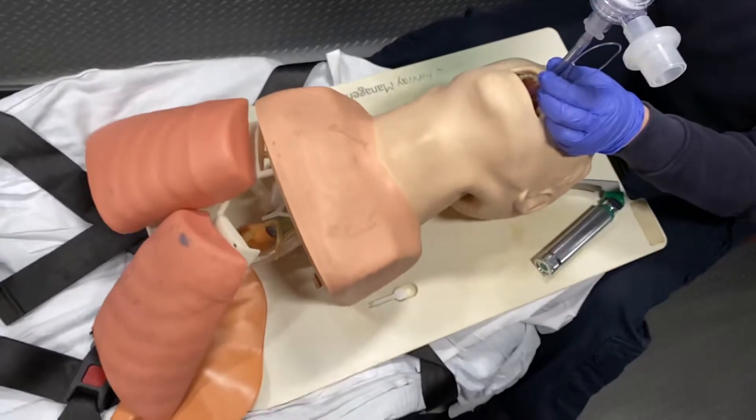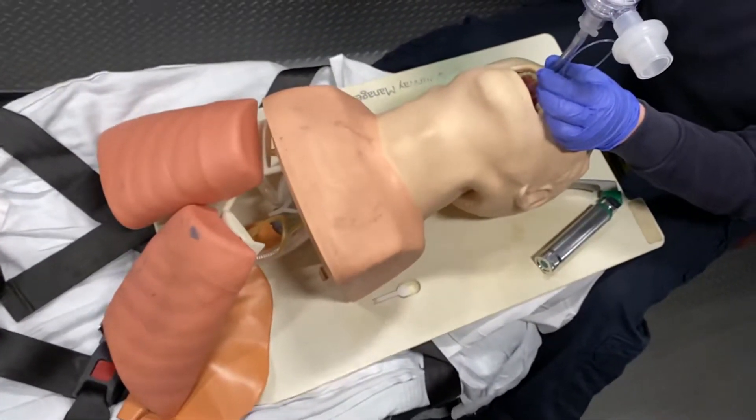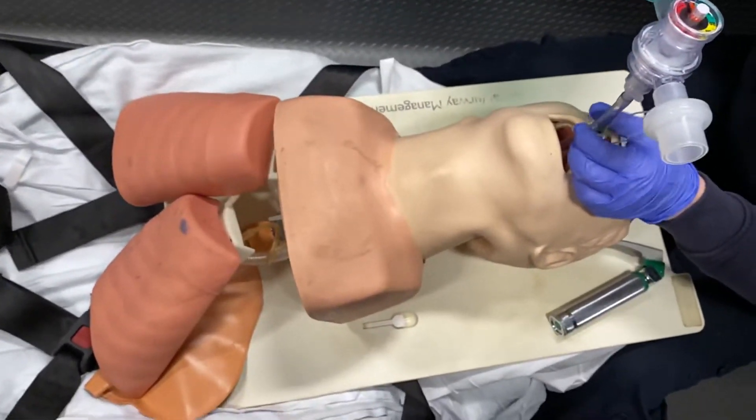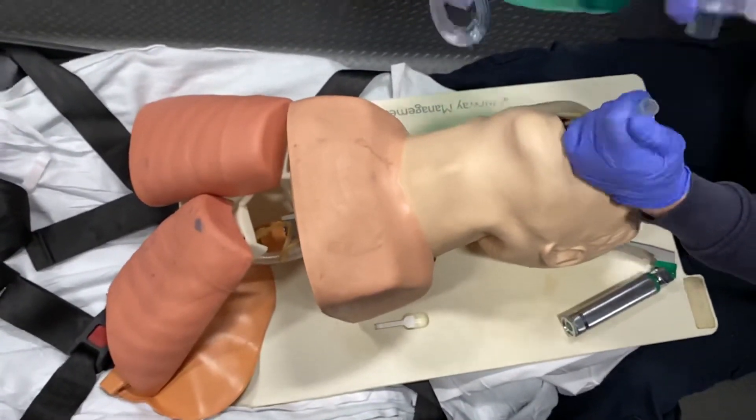Make sure we do not hear any air sounds over the epigastrum. Remember, we're going to ventilate one breath every six seconds.